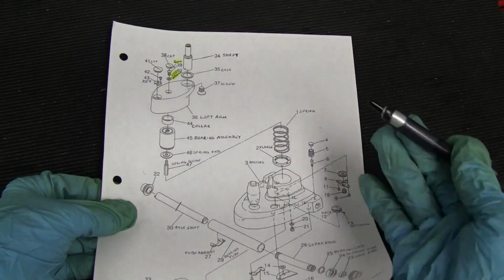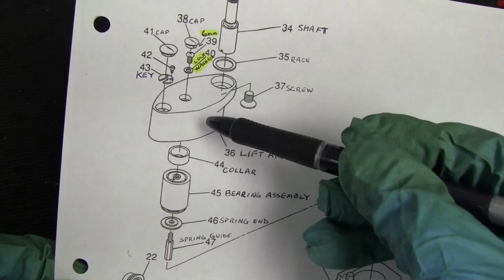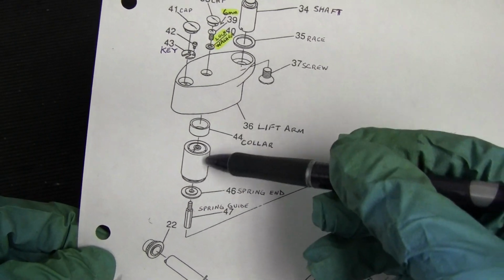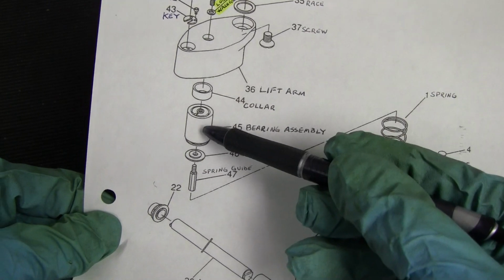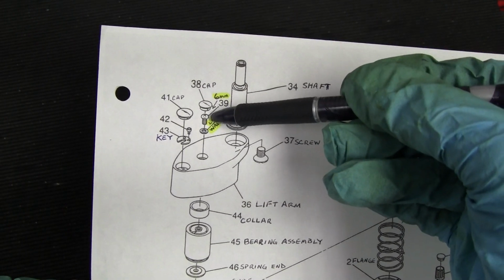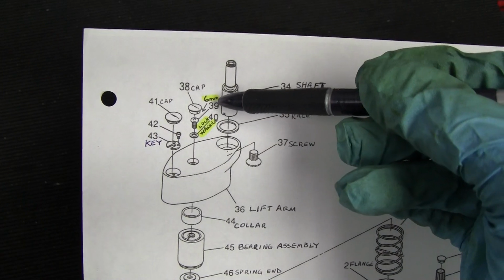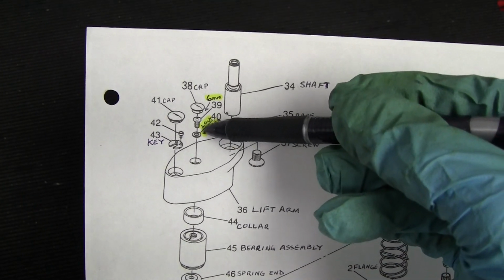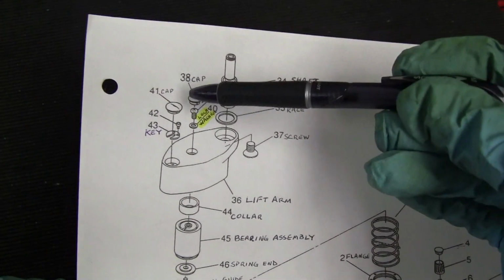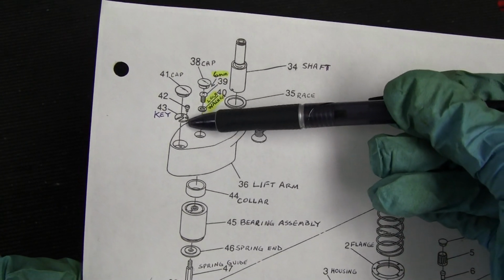Of course, we have our spring. And here is the lift arm. And there's a brass collar in here. Here's our bearing assembly. And here's our screw that we replaced. It's a 6mm screw, and I put one that was 18mm long. And that's what you want to trade out. You want to trade that washer out and put a lock washer there. These are your caps, and then this is the key that slips on the shaft below.